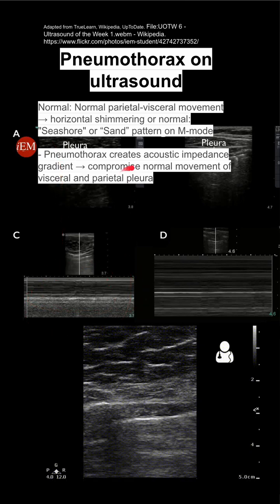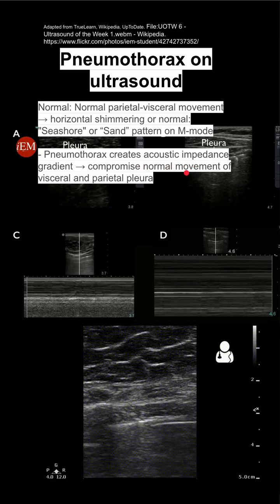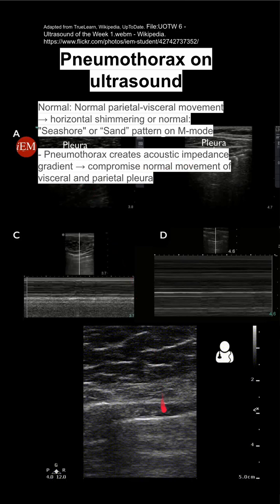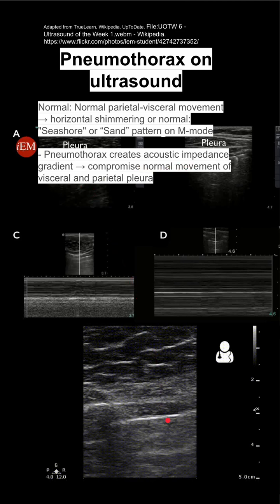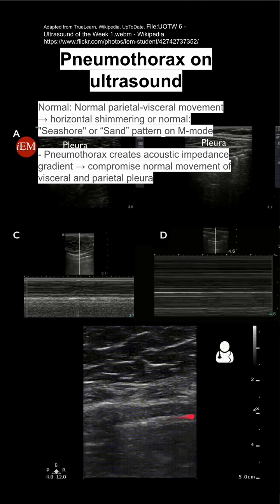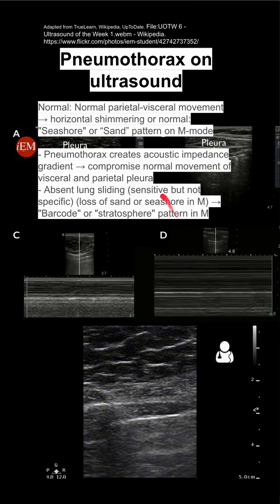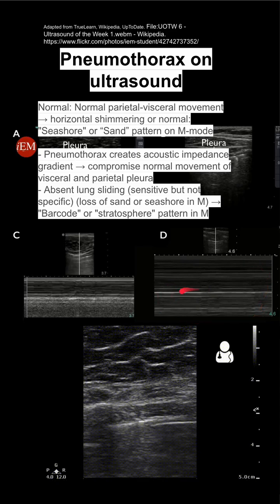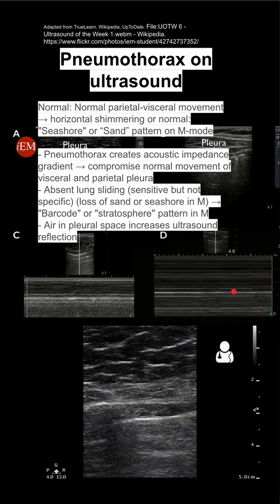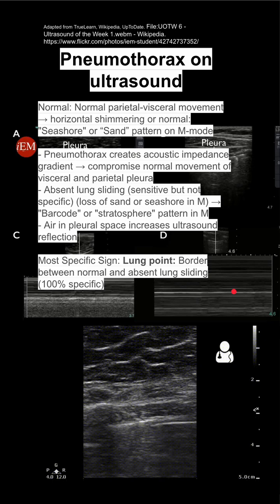With a pneumothorax, you'll have acoustic impedance which compromises the normal movement of the visceral and parietal pleura. You can see a pneumothorax moving in and out of frame in this GIF. You'll also see loss of that sand or seashore pattern, and instead you'll have a barcode pattern in M-mode. Air in the pleural space increases the ultrasound reflection, and that's why you have this pattern.